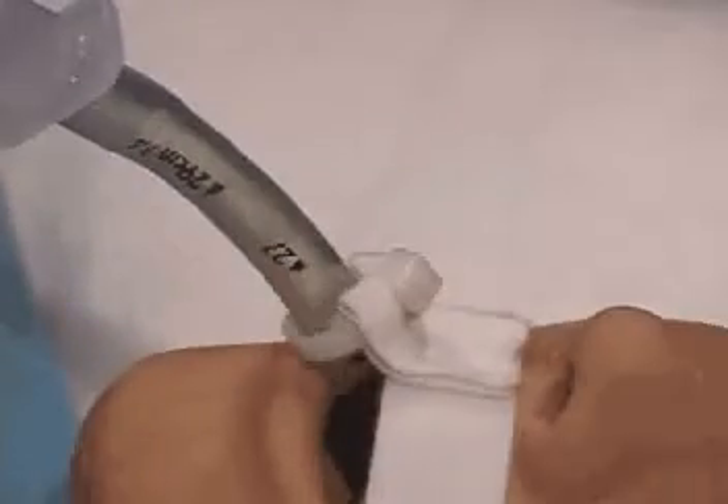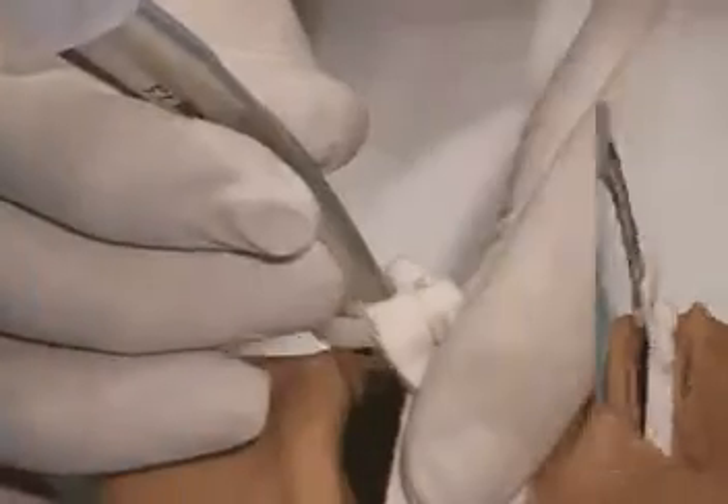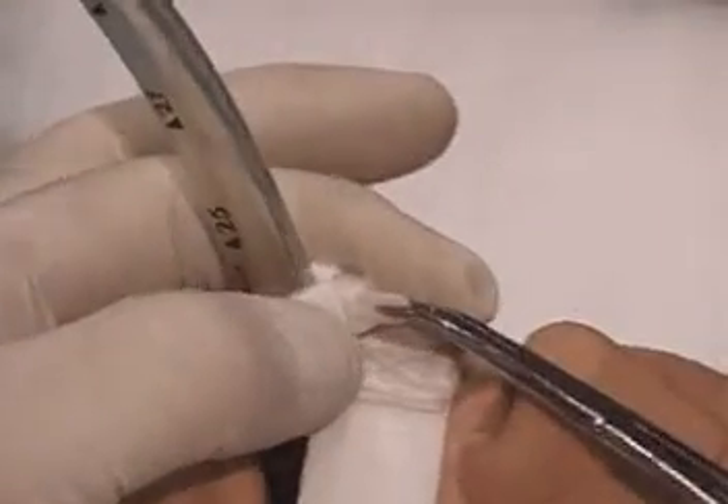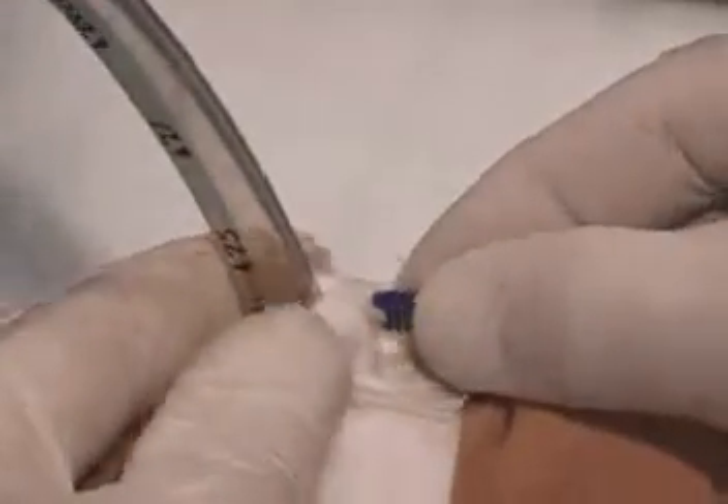To reposition the endotracheal tube, deflect the release lever and push the excess tab through the retaining unit. Reposition the endotracheal tube. Retighten the cable tie using a hemostat. Replace the blue cap on the end of the cable tie.